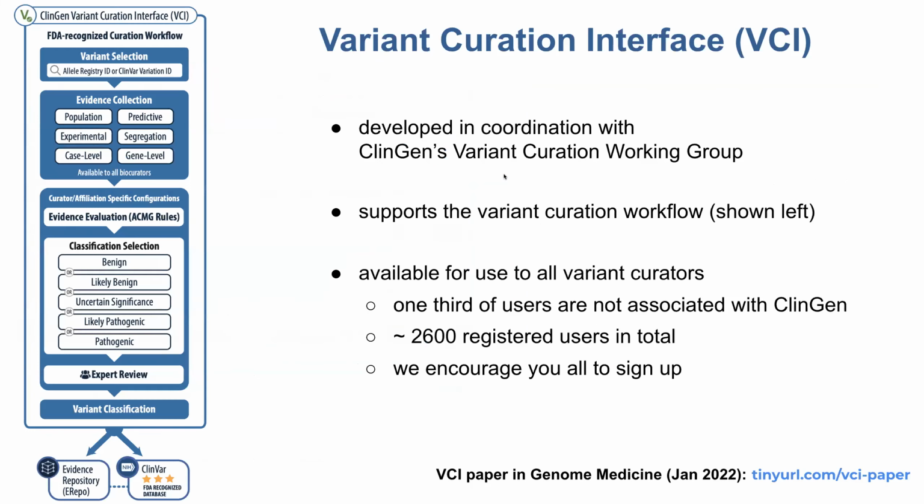The VCI was developed by ClinGen's variant curation working group to support variant curators in their work. It was specifically designed to support the variant curation workflow you can see here on the left. I'll give a quick overview of that workflow now before I go into each of the steps in a lot more detail. So starting at the top, you can see the variant selection.